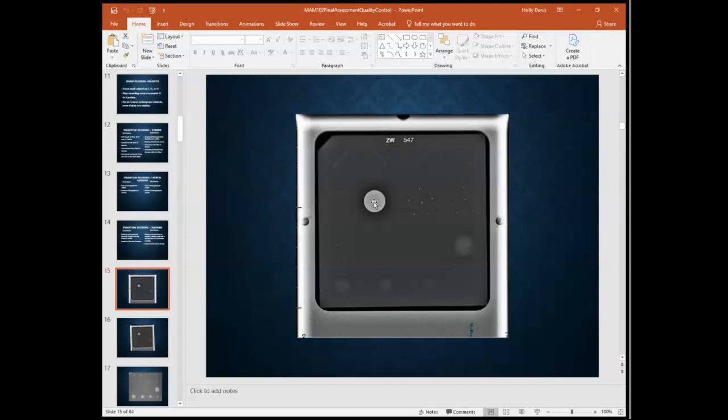Some facilities will use this little disc to make sure, and they'll just move it around on different images. We're not going to really focus on that right now, because that's not something that's in this manual. But there would be a little fiber underneath there, which we can't see, so we obviously can't score. So we have 1, 2, 3, 4, 5 out of the 6, so that gets 5 points.